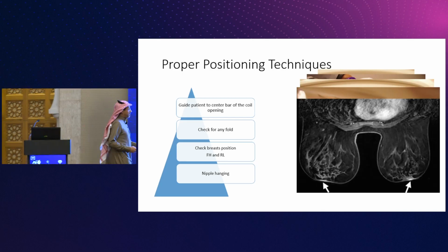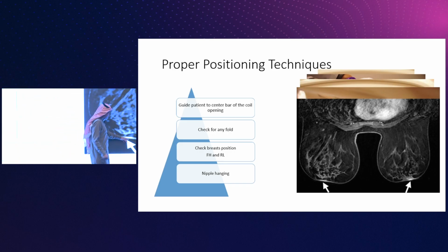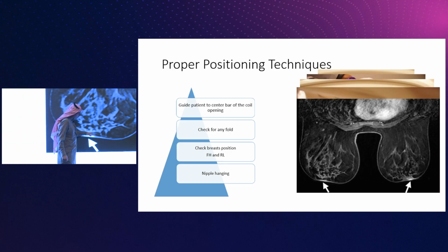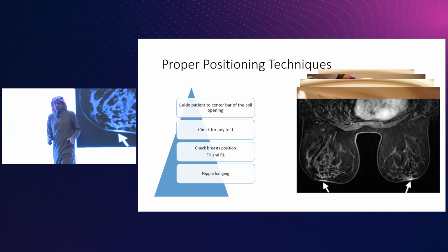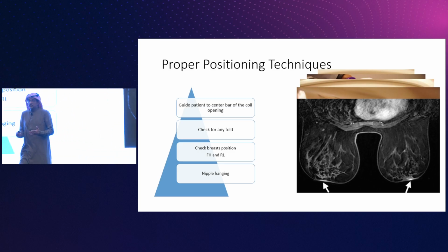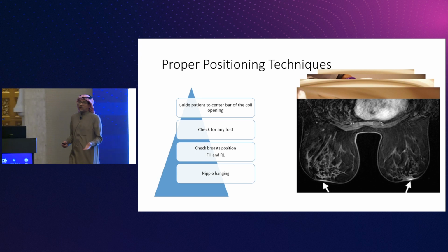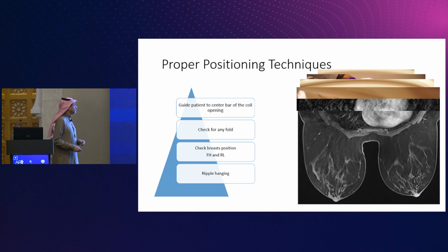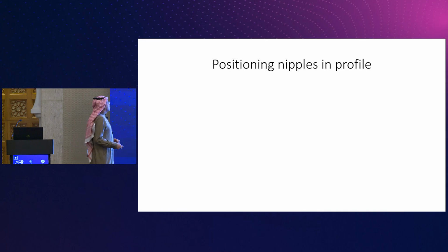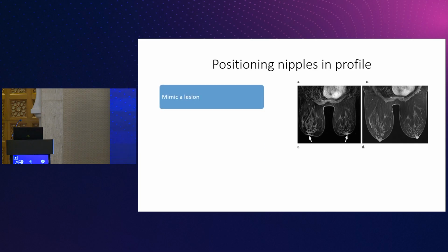You see here, it's really serious. You didn't see the nipple. That's compressed. Contrast isn't flowing correctly, smoothly through the tissue, and that might cause a false negative or even a false positive. So it has to be this way. See here, also the same.